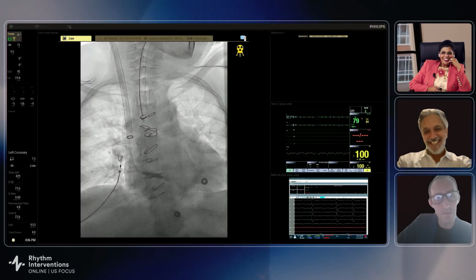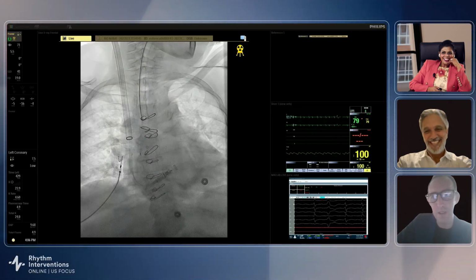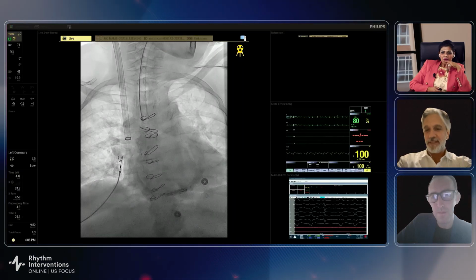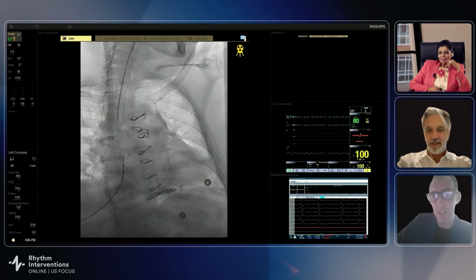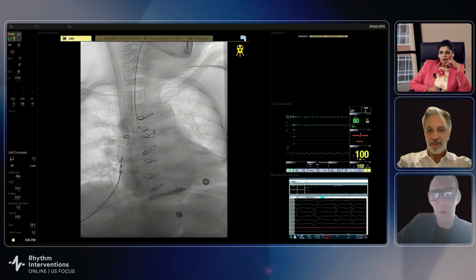Okay, I think that's gonna cross. Anesthesia for these cases, Mikhael. Yeah, here's one. We did use anesthesia in the first two or three, but now we don't. We use MAC, just sedation. Yeah, MAC sedation.